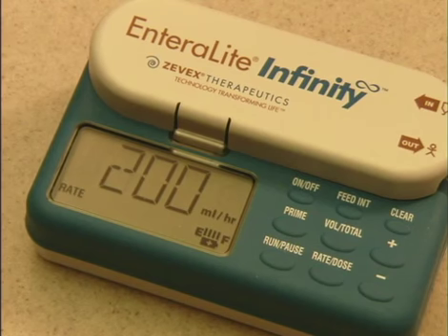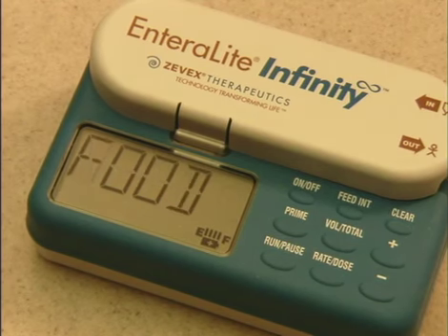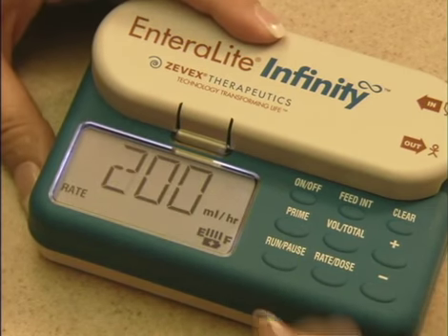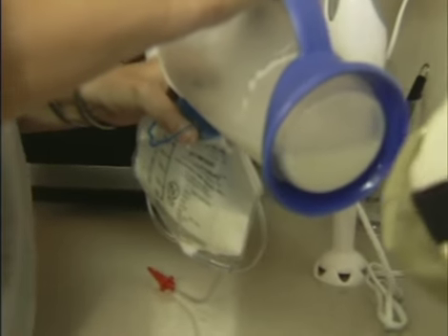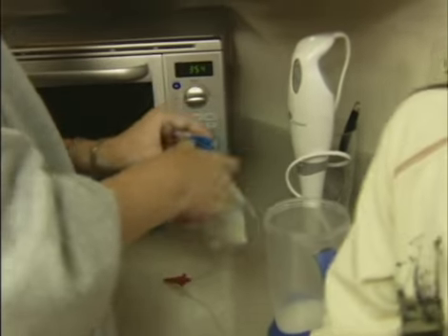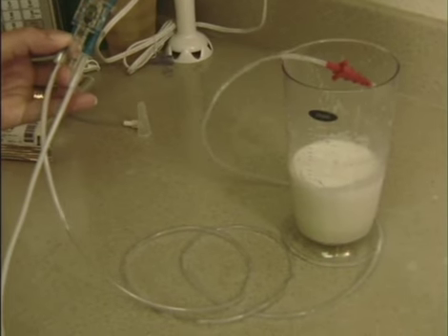When the pump detects air in the tubing, the words "No Food" will appear in the display and an alarm will sound. To correct this problem, first press the Run Pause key to silence the alarm. Check the feeding bag for food. If it is empty, refill and reprime the set. Check the tubing for air bubbles.